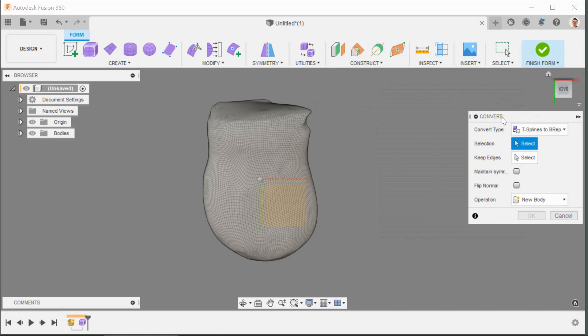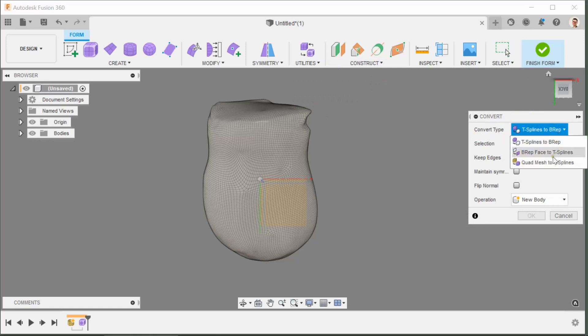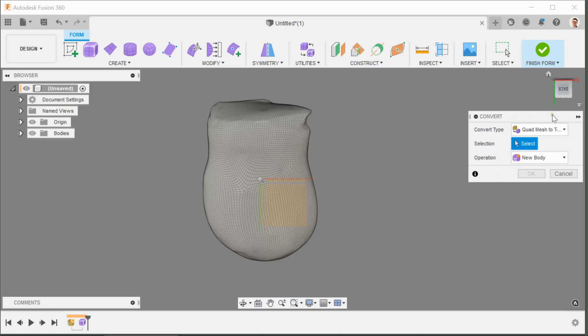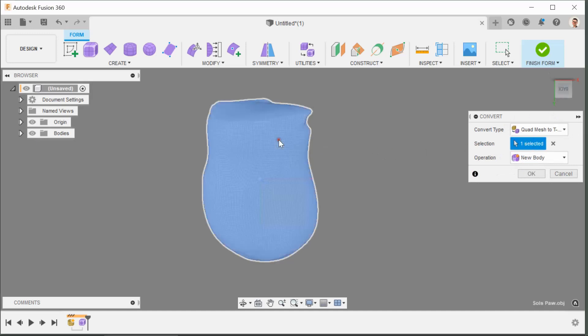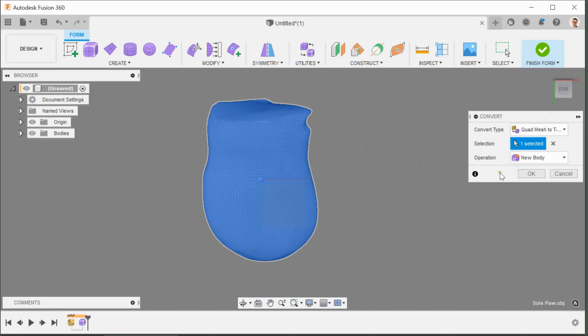Right, so make sure now that everything in the dialog box is done properly. We want to convert quad mesh to T-spline. We're going to do that to this body, so it's asking in the selection which body do you want us to convert.